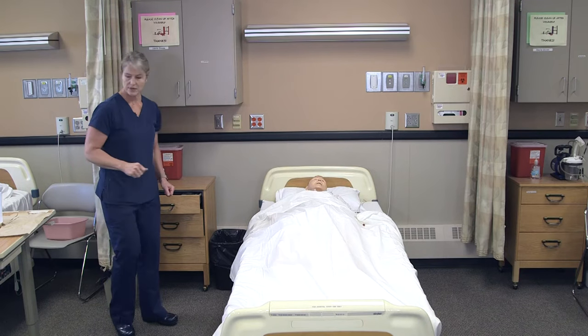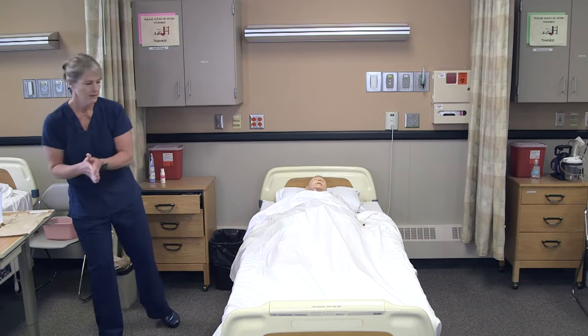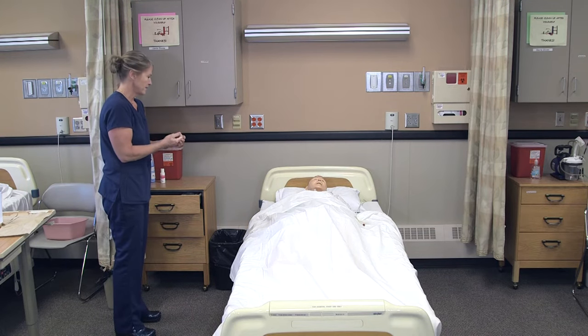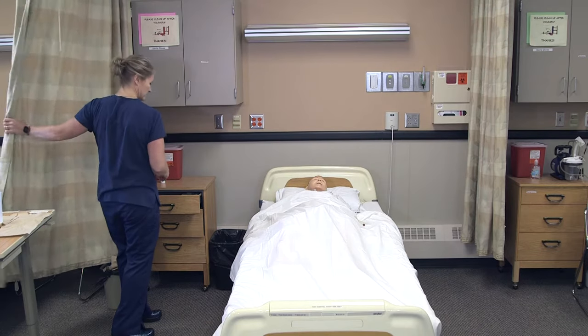I will knock on the door and wash my hands. Hi Lee, it's Myra. I'm here to empty your catheter — is that okay? Okay, I'll provide for privacy.